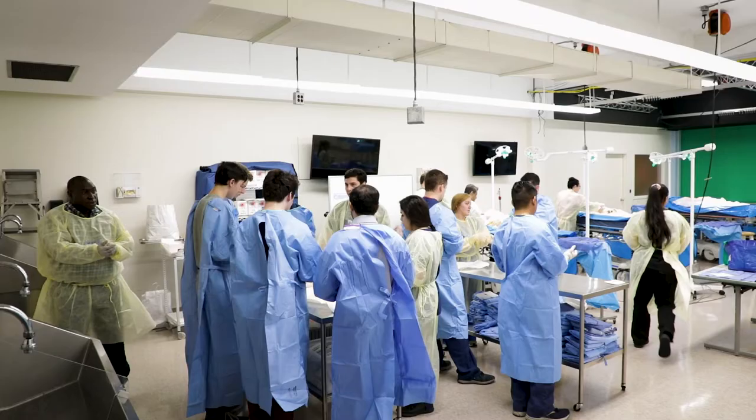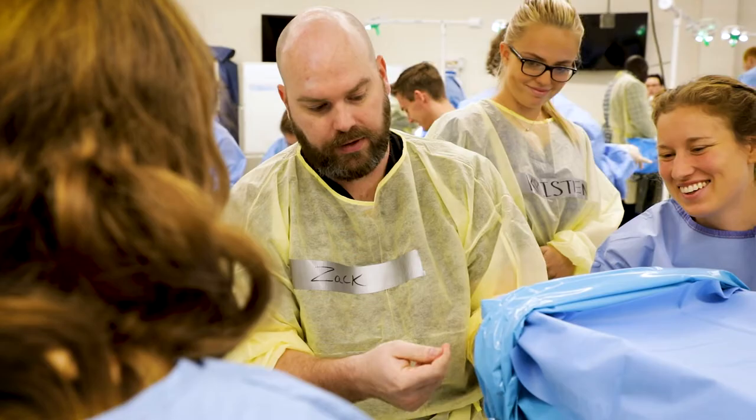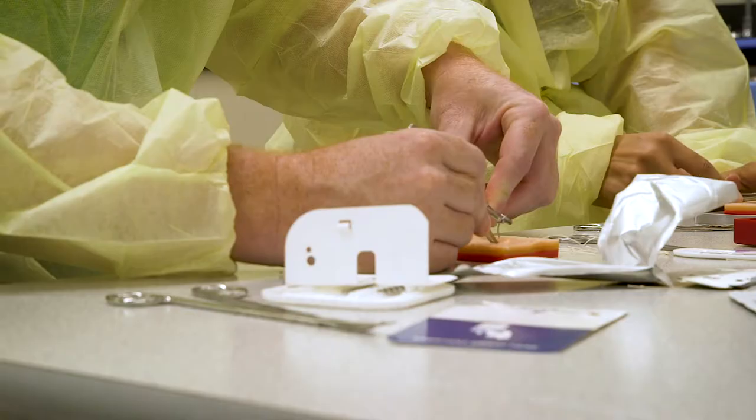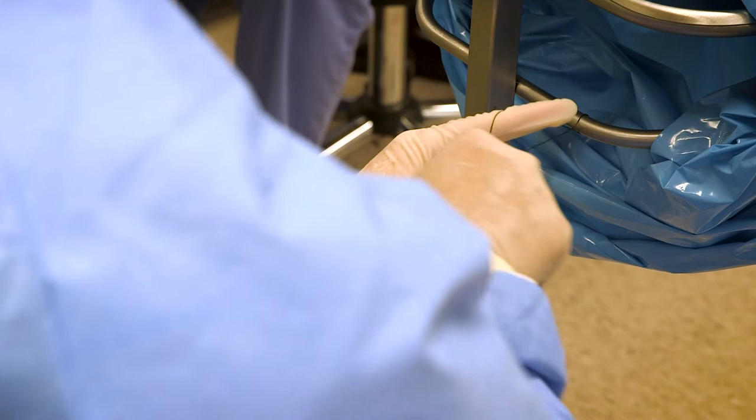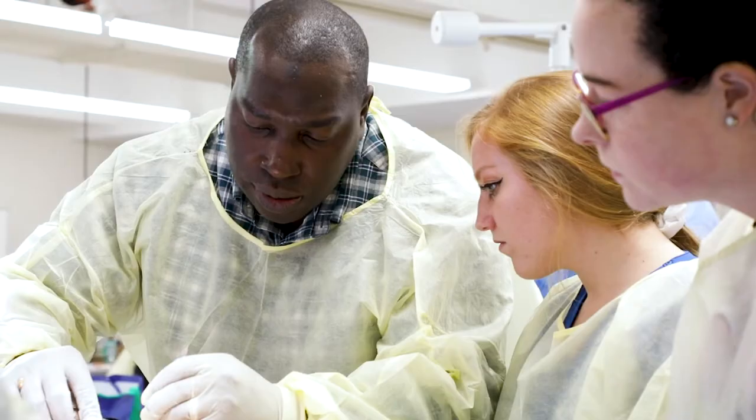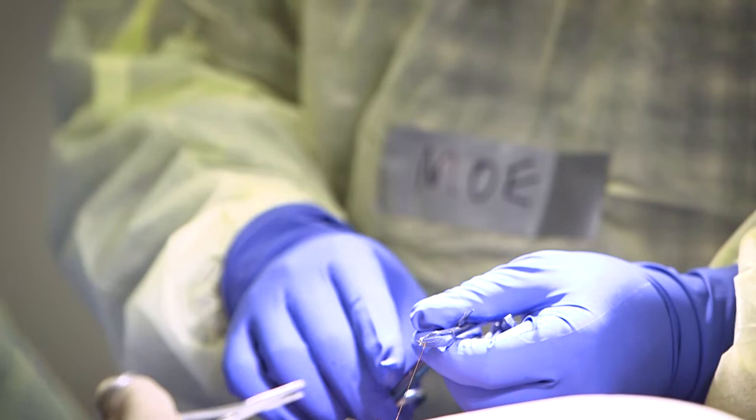This is Suture Fest. The SA program is essentially running it, bringing in med students and people from other programs to come and learn how to suture. Teaching basic knot tying and instrument tying. We have gel blocks to learn basic sutures, and then we have some more experienced students teaching on donor bodies as well.